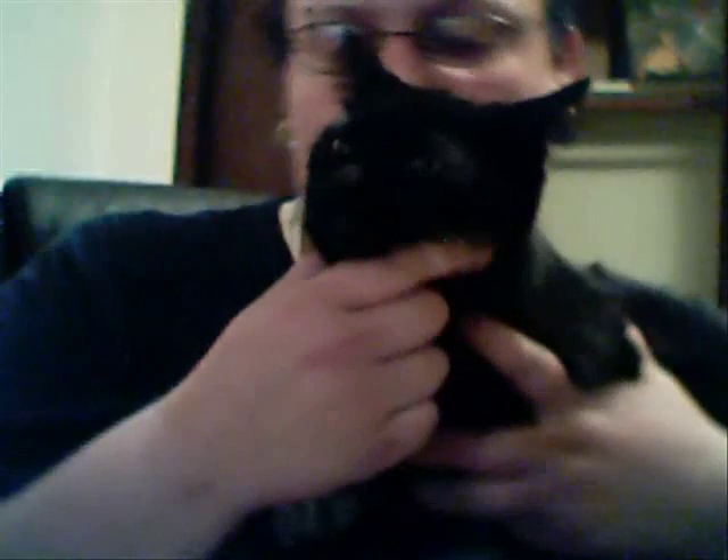Hey everyone, this is Shadow — he's going to be our patient today. Before we begin, I always like to have some treats on hand. Recently he's been switched to the raw diet; I would highly suggest this. And as always, make sure you have a clean area to work with — and a husband nearby to hold your camera.